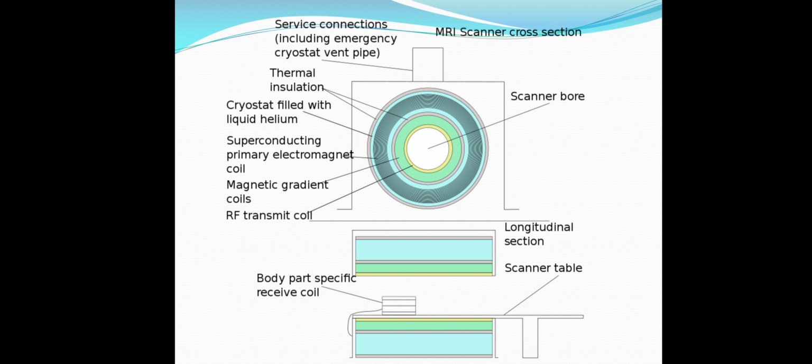To perform a study, the person is positioned within an MRI scanner that forms a strong magnetic field around the area to be imaged. First, energy from an oscillating magnetic field is temporarily applied to the patient at the appropriate resonance frequency. Scanning with X and Y gradient coils causes a selected region of the patient to experience the exact magnetic field required for the energy to be absorbed.